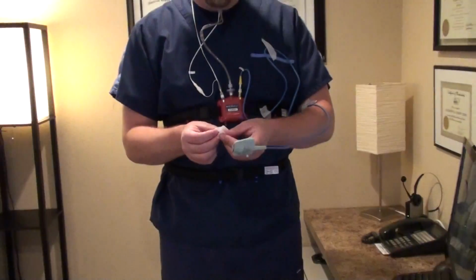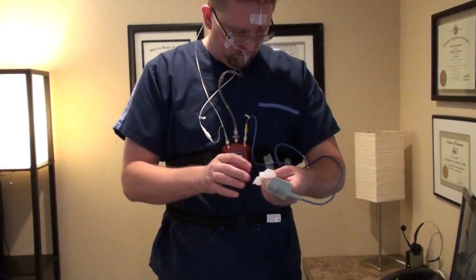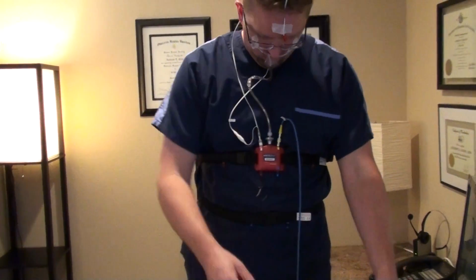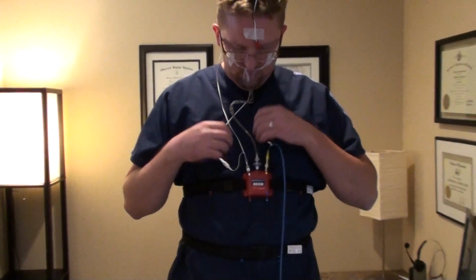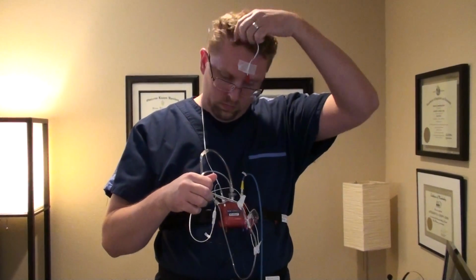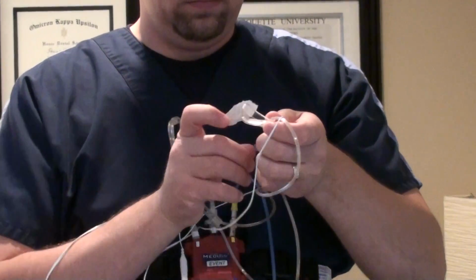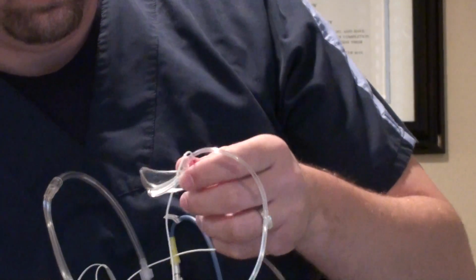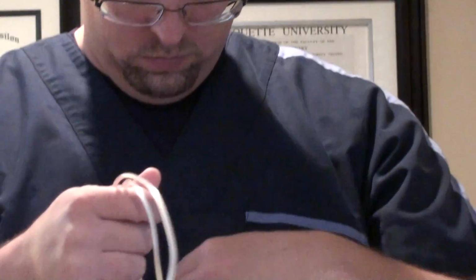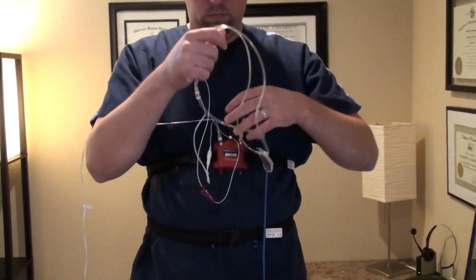Please leave all cords plugged into the MediByte machine. I have supplied you with a Ziploc bag to place the MediByte and all cords in to bring back to the office. The plastic tubing with prongs that you placed in your nostrils, we ask you keep at your house should Dr. Crow need you to perform a follow-up MediByte test. Keeping this tubing will ensure that we won't have to charge an additional fee for the tubing with the next study.